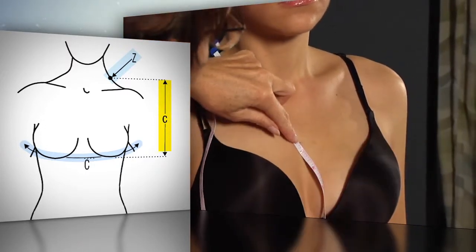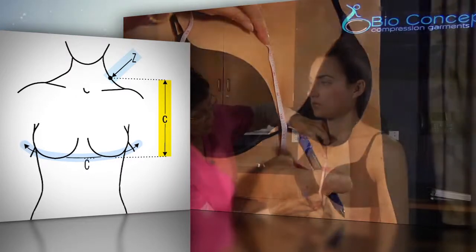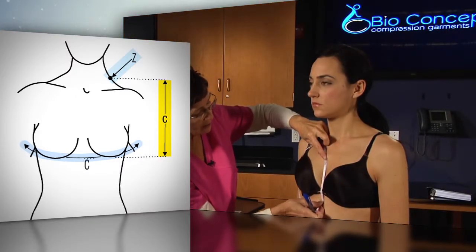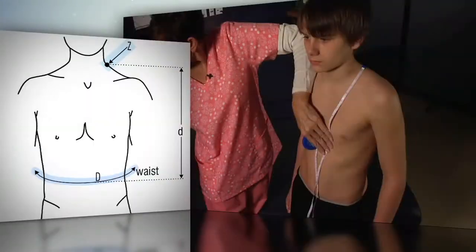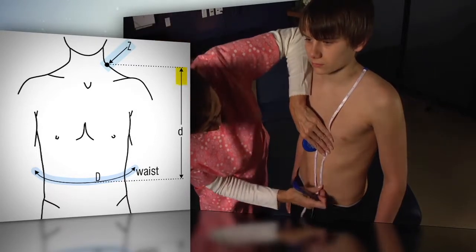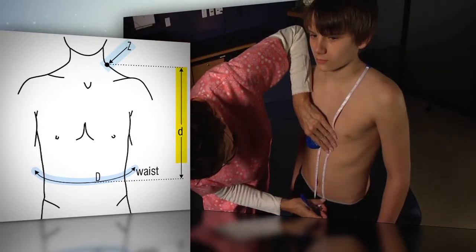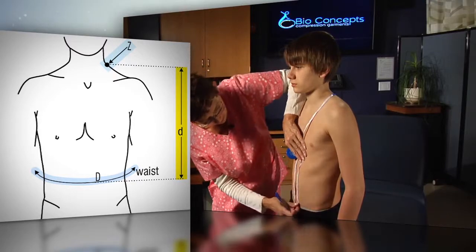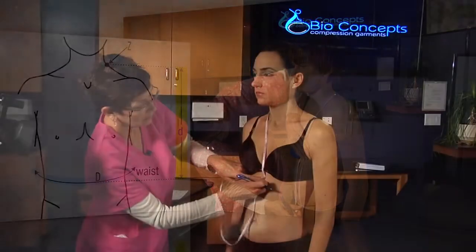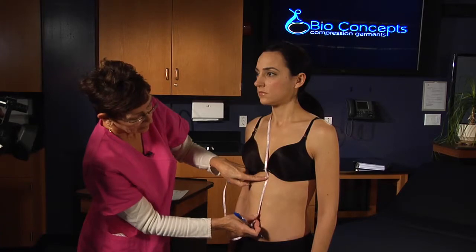For an adult female, the little c measurement is the distance from point Z to the capital C circumference measurement, directly below the breasts. The little d measurement is the distance from point Z to the capital D circumference measurement, measured straight down the anterior torso between the breasts for an adult female.